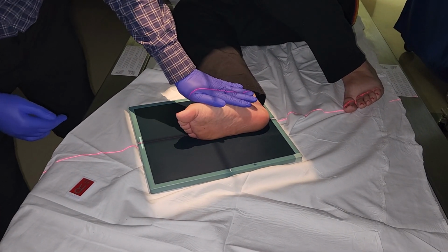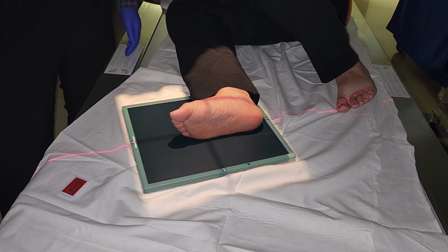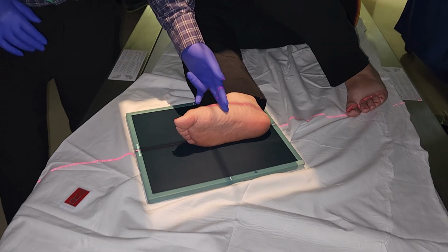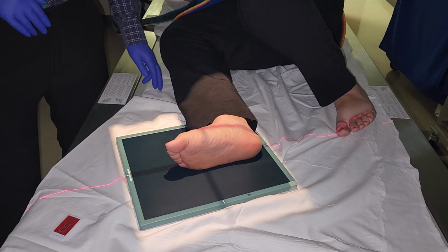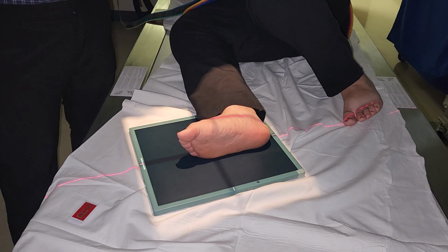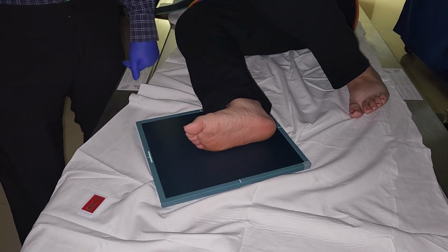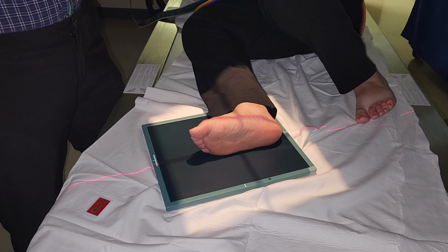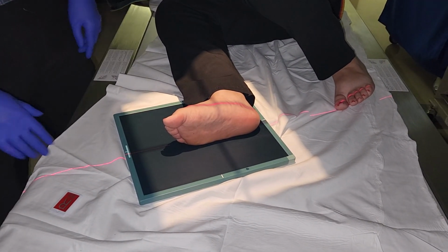So now we need to do our centering. Where do we center for the lateral foot? Midfoot. So we're still going to aim at approximately the location of the base of the third. In this case, you can't really see the base of the third. That's okay, so just go in the middle. The midfoot.